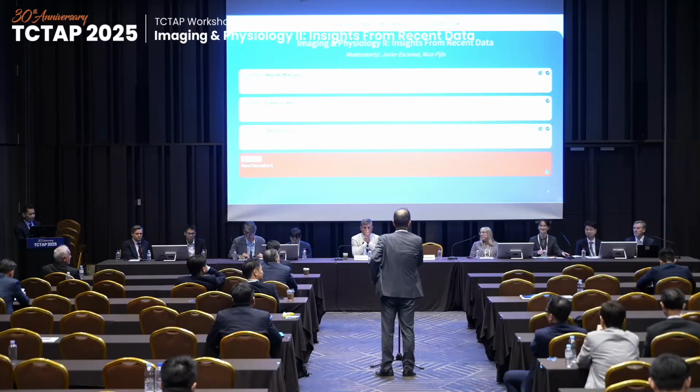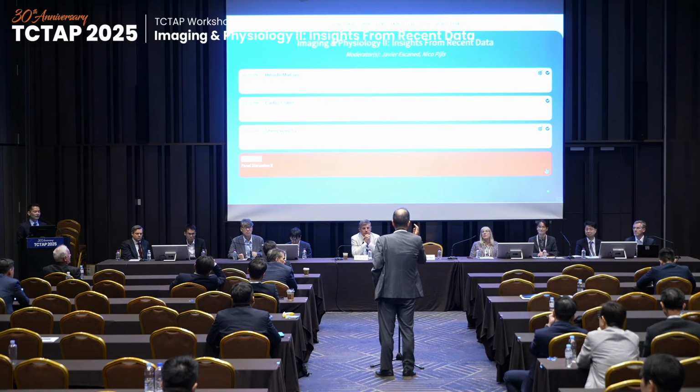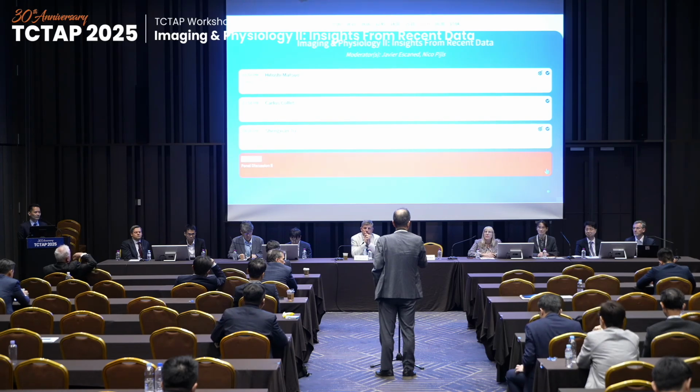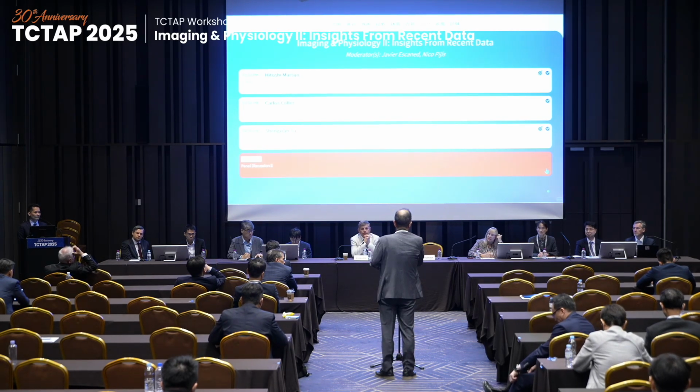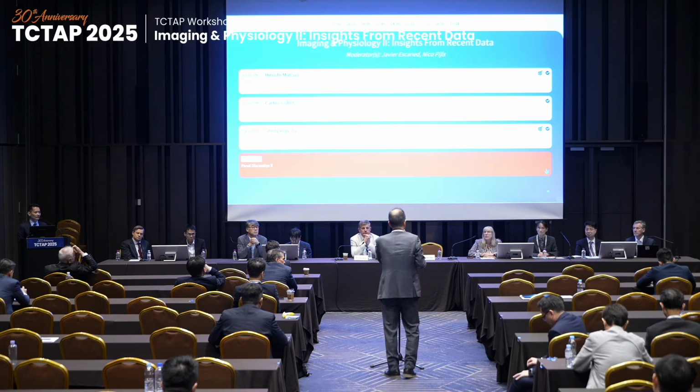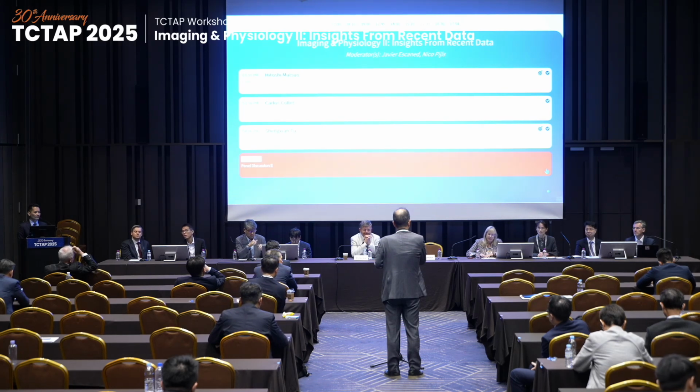No, we have. For example, I believe that the myocardium perfused by the vessel is really very important. For the lesions with myocardial infarction or microvascular dysfunction, there's some kind of discrepancy between the functional coronary angiography and the real FFR measurement.